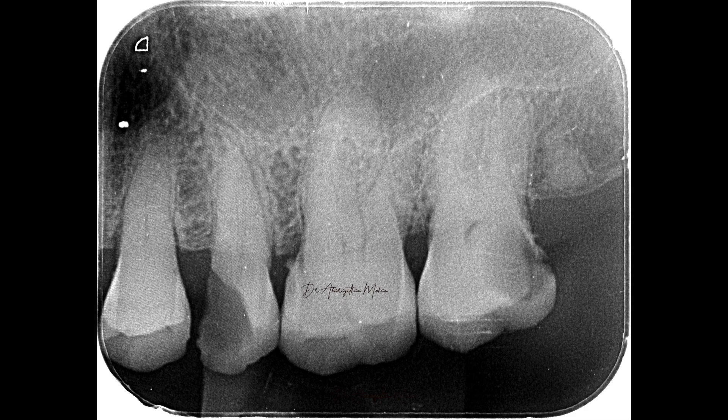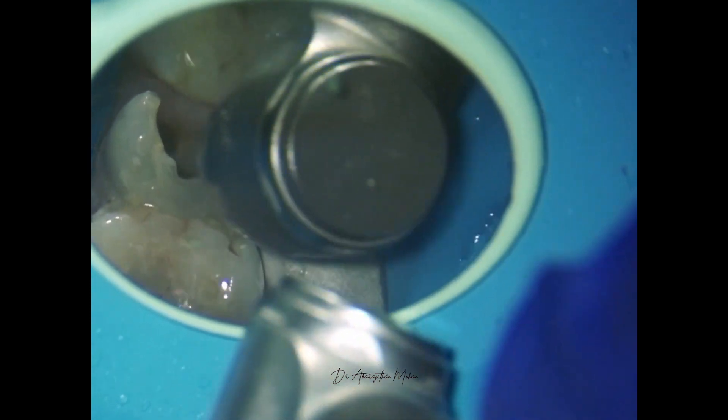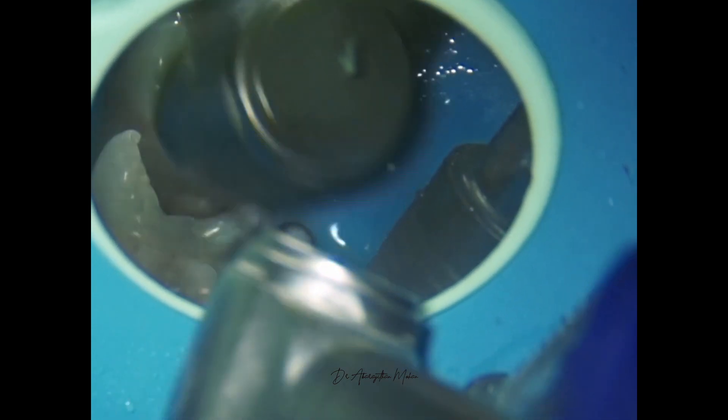In this particular scenario, you can see we have a maxillary second molar which requires endo, and you can see the pulp chamber is completely sclerosed — we do not see a nice and big pulp chamber. I would rate this case a little difficult. Upon isolation, when I begin my endo with the conventional airotor bur, you can see the airotor burs are pretty short in length and the head of the high speed handpiece is blocking my vision. This is dangerous because the height of the pulp chamber is too narrow.